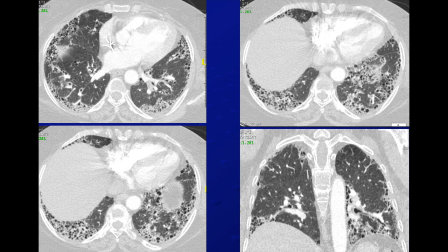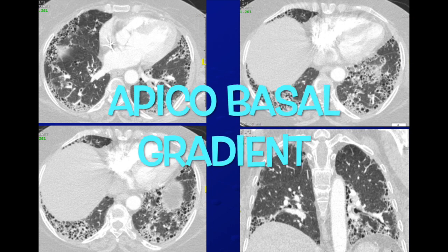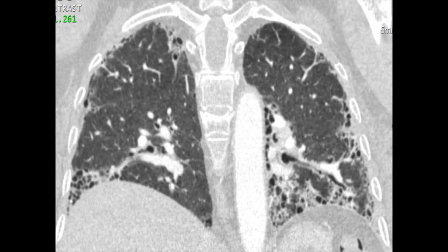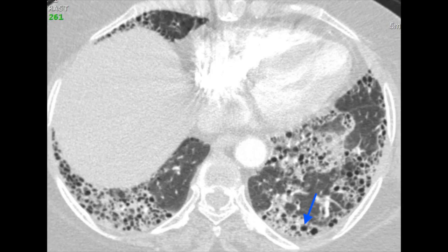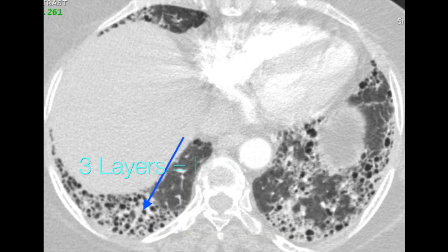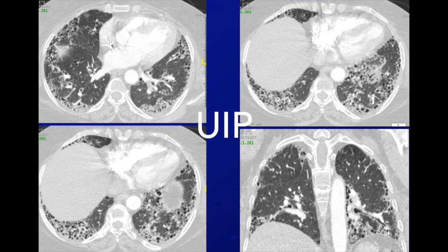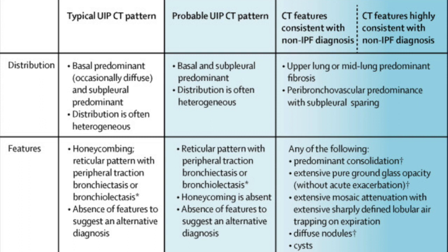Looking at this case: is this honeycombing? Yes. Is there an apicobasal gradient? Yes — there is more in the bases than the apices. There is traction bronchiectasis and cyst formation. But when it comes to UIP, there are categories: probable, typical, or non-consistent with UIP. This is a newer and important classification that chest physicians will ask about.